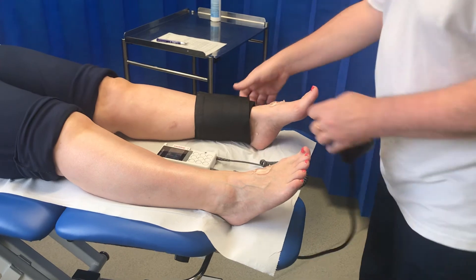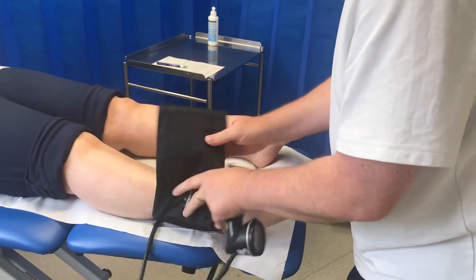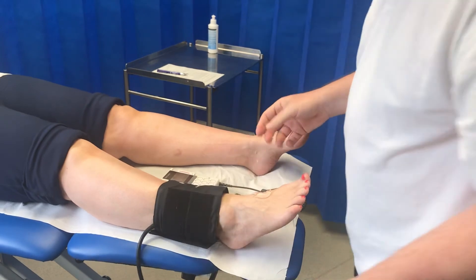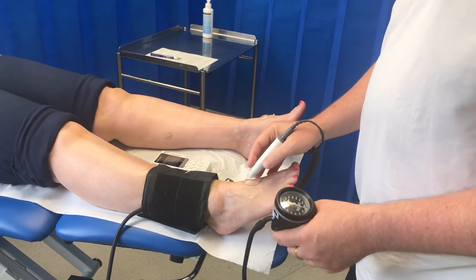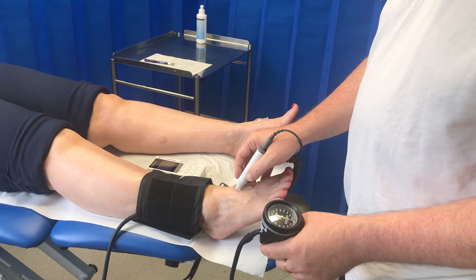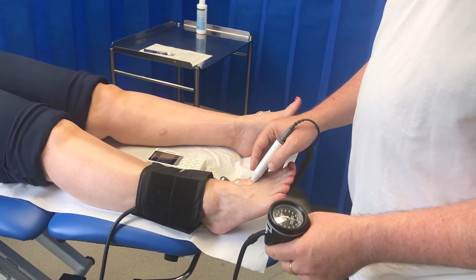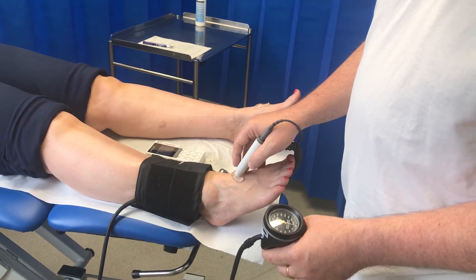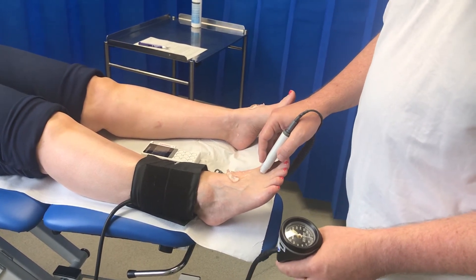I'll make a note of that pressure, remove the cuff, and finally do the pressures on the remaining lower limb. I've put the cuff on upside down here to make sure that the tubing is out of the way of the gel at the ankle. Again, I'll search for the dorsalis pedis pulse by sliding across the foot with plenty of gel. Now if you can't locate the pulse in this area easily, come down to between the first and second toe.